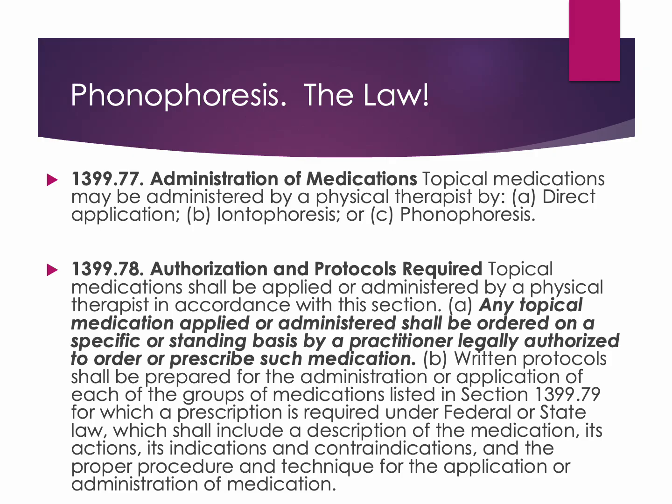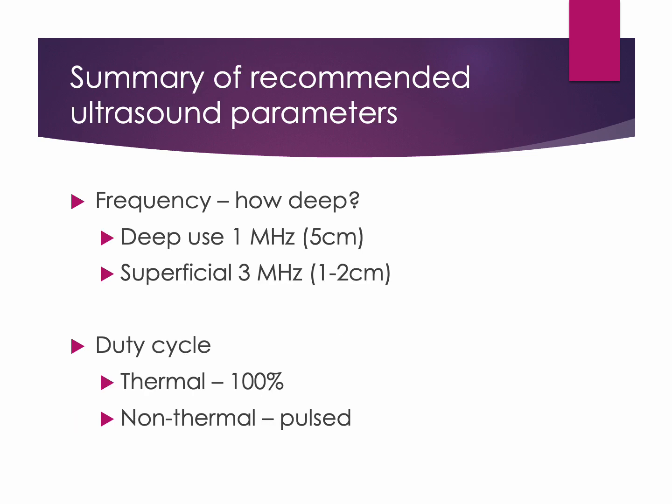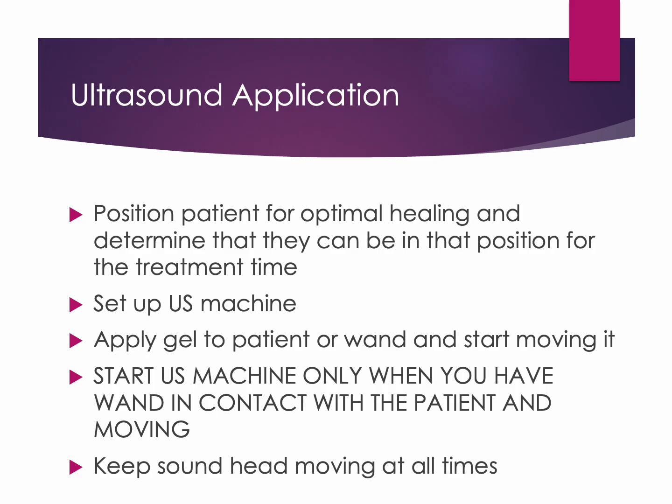For non-thermal ultrasound, we use pulsed mode, lower intensities, and treat for about 10 minutes over an area approximately twice the ERA. Remember, frequency determines depth, and duty cycle determines whether the effect is thermal or non-thermal. For the sake of this class and best practice, perform your treatment in the following order.